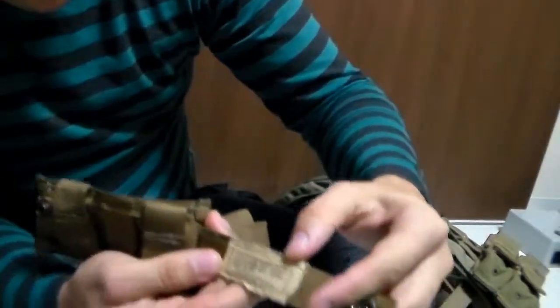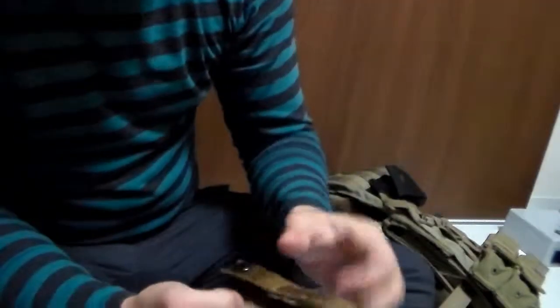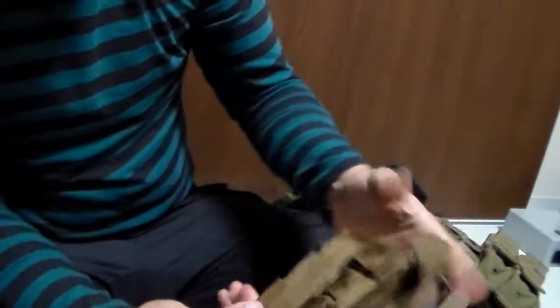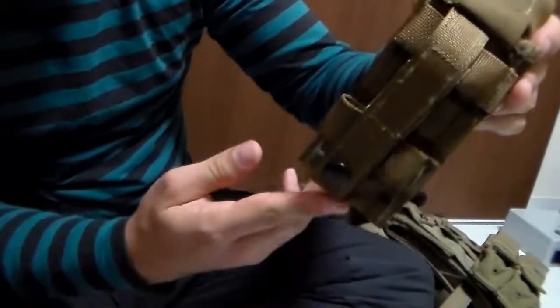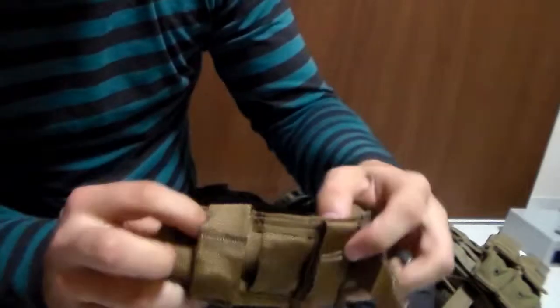The second, which is actually the issued tourniquet holder, is the CAT tourniquet holder by North American Rescue. This is the actual issued one I didn't know about until I saw my buddy Gojira with one. You can set it up like a normal holder where it'll go straight through, or you can actually set it sideways through a belt.